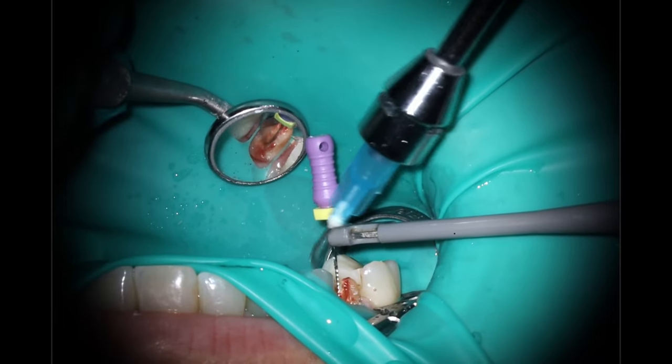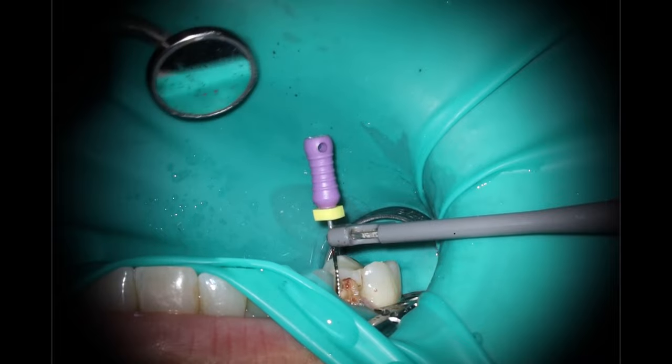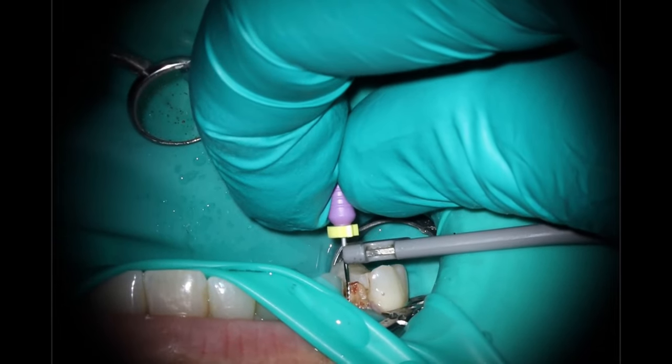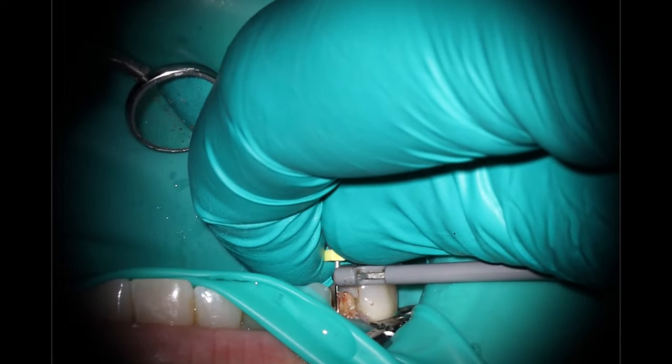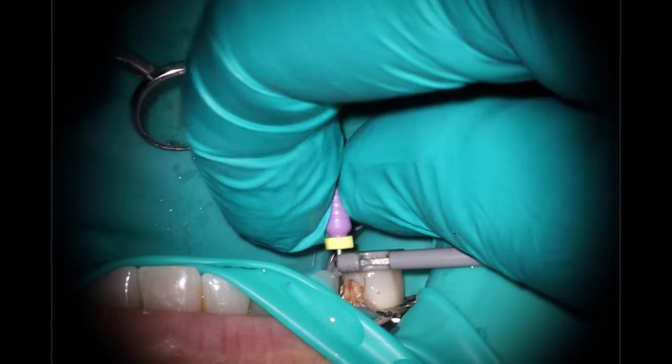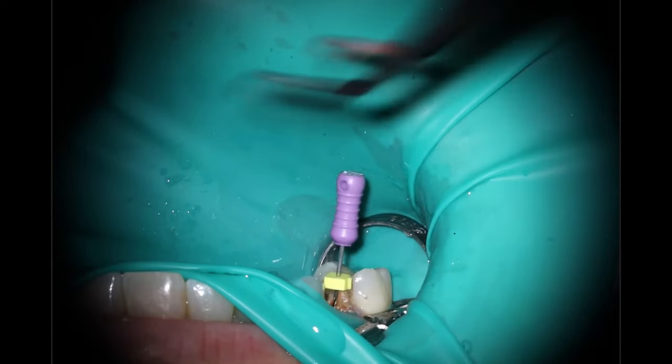As far as finding the working length, this one was a little funky. There was some bleeding that was throwing off my apex locator. This was done with an apex locator that I think is starting to go bad — it's been dropped a couple of times and goes on the fritz every now and then, so I probably need to replace that. Just working at it with a little watch-winding as we go down, getting an accurate measurement.